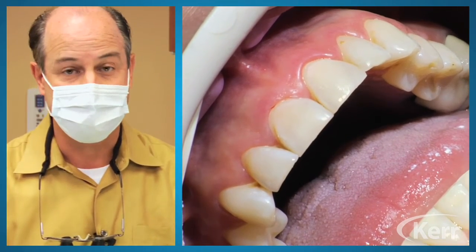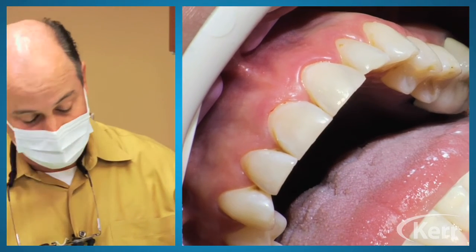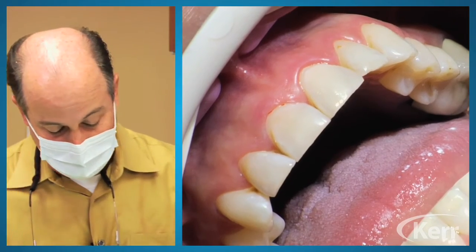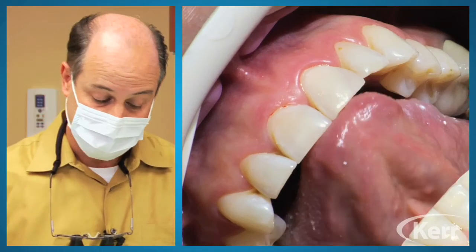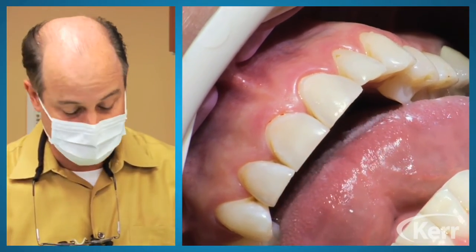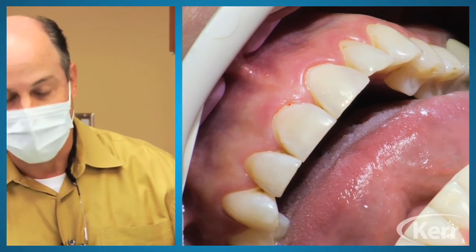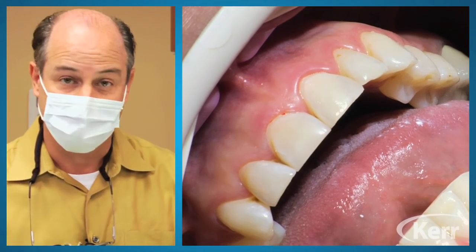And now I've come back with just a little composite polishing paste and a goat hair brush, and I think you can see that that's some pretty nice luster there for that restoration, and it blends in seamlessly, which is really what we're trying to do. It blends in seamlessly and mirrors the adjacent tooth, which is really the criteria for a nice direct composite restoration. Hopefully this will benefit you in your practices, and you'll be able to deliver restorations at just a little higher level from this point forward. This is great with this great material, Herculite Ultra.